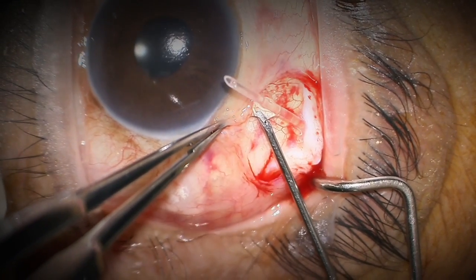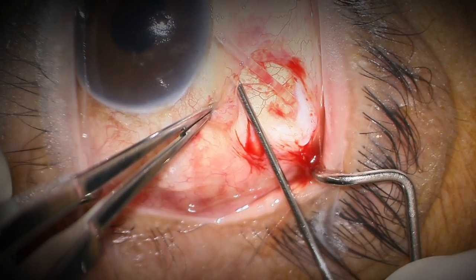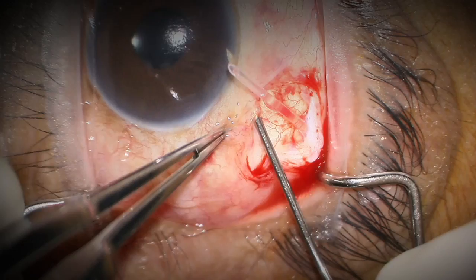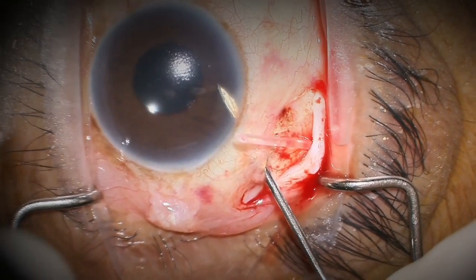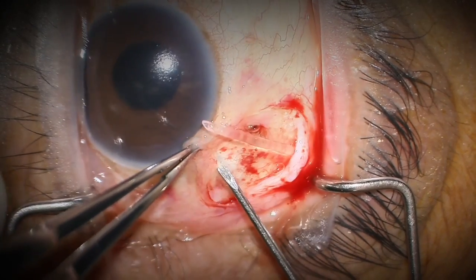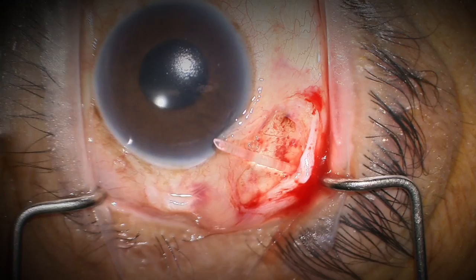This is a pseudophakic patient. I'm going to place the tube through about a 3 or 4 millimeter tunnel into the deep anterior chamber, going tangentially across it. This is important for the sutureless technique — if the tube happens to migrate, it's not going to migrate into the visual axis, and with deep tube placement it won't migrate towards the endothelium either.